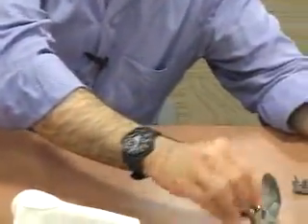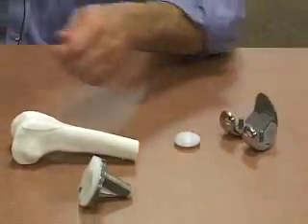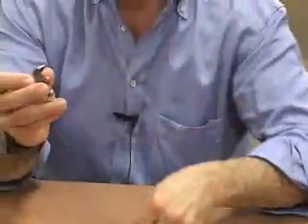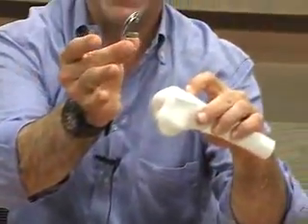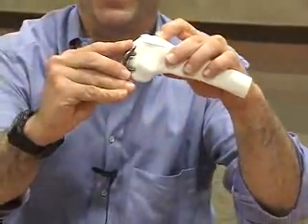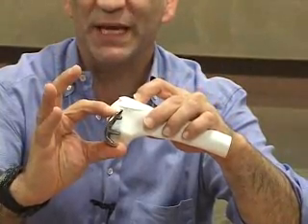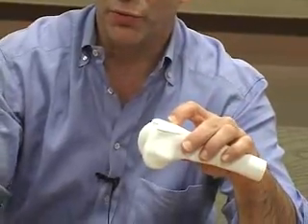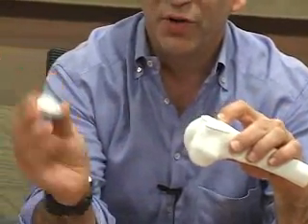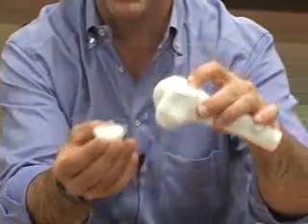With a partial knee replacement, instead of replacing the entire end of the femur, you only replace half of it. So utilizing this model, this is a partial knee replacement, and this would fit on like so. You would only put it on either the inner or outer half of the bone. And then the same thing goes through on the shin bone. You would place this on half of the shin bone. So rather than replacing the entire knee, you only replace part of the knee.